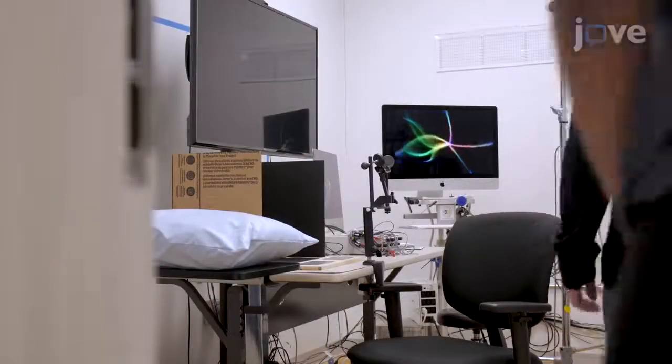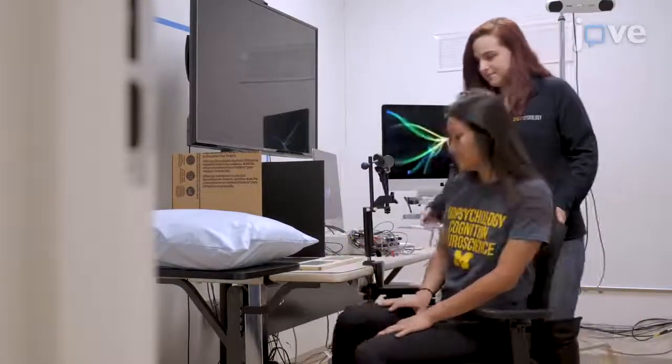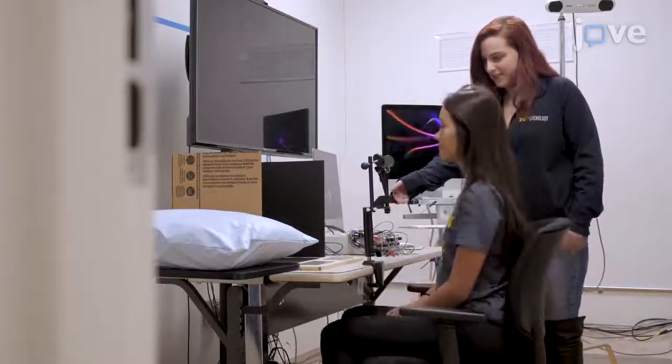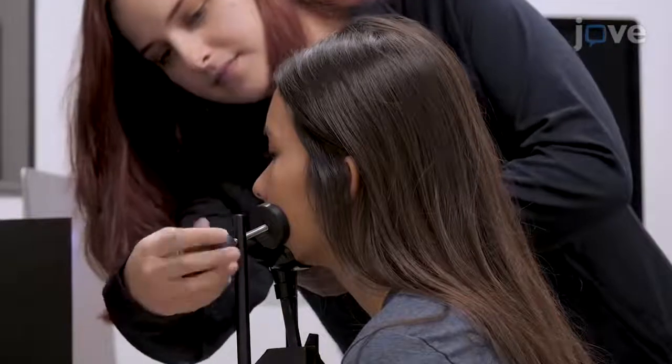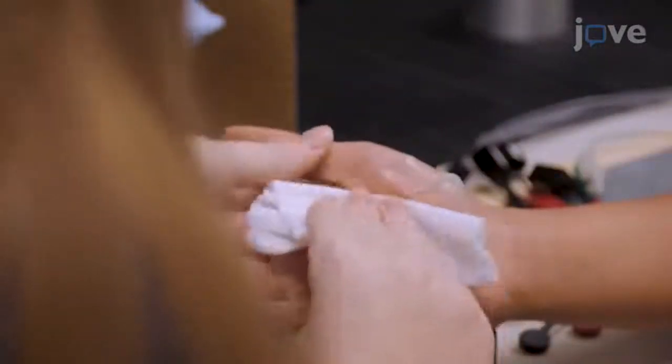For placement of the EMG electrodes, have the participant sit comfortably in the experimental chair with both arms supported in a relaxed position, and provide a chin rest to keep head movement to a minimum during the stimulation. Use a mild abrasive to clean the skin over the muscle of interest.